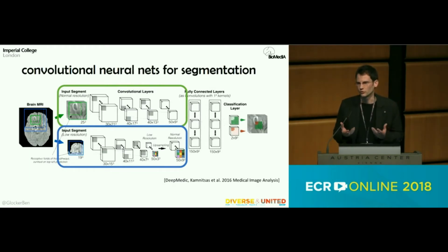If you think about traumatic brain injuries, for instance, they usually tend to happen at the front of the brain because maybe you had a car accident. So learning the context, knowing where you are in the image and where you are spatially located is important for these systems. So you need to think about certain types of architectures that do allow you to capture that information.